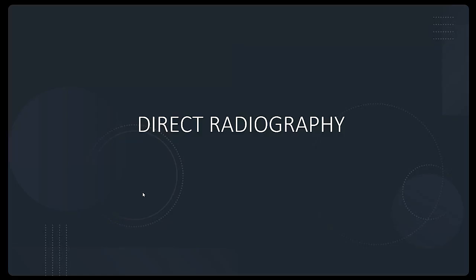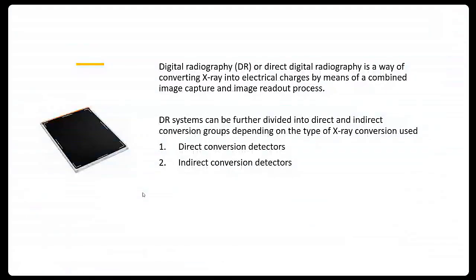Now let's come to direct radiography, which is the most advanced form of digital radiography. So, direct digital radiography or just direct radiography is a way of converting X-rays into electrical charge by means of a combined image capture and readout process. So, DR systems can be further divided into direct and indirect conversion groups depending on the type of X-ray conversion used.